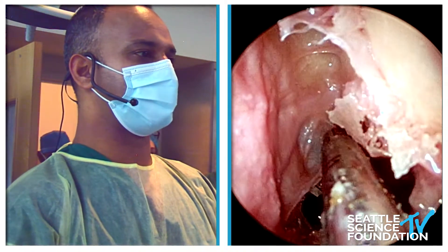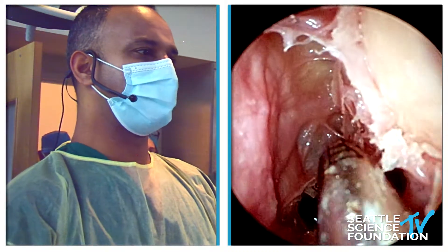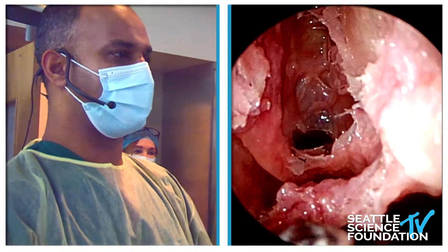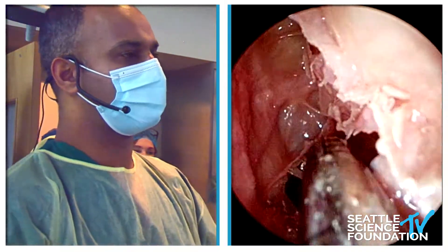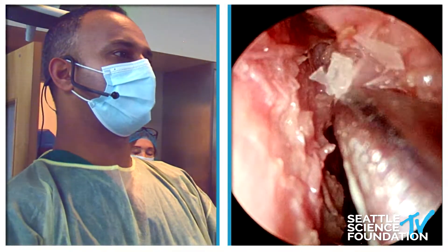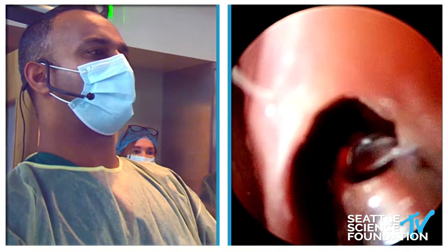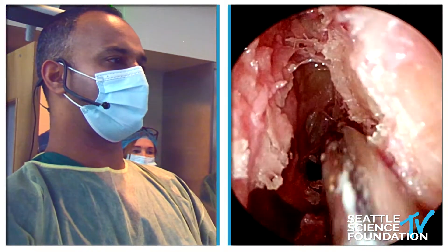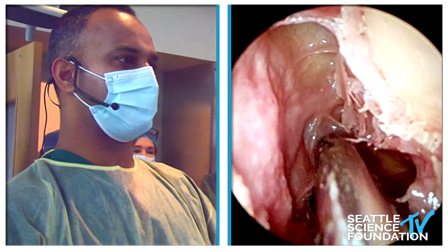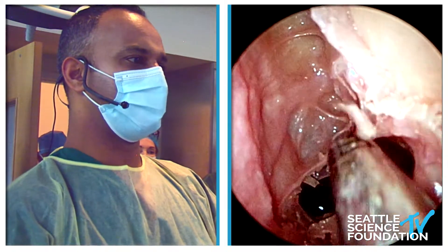Because when Greg showed us with that balloon, we saw the supra-agger frontal cell that goes past the ostium. Here you can see that Winston had nicely broken away all these, but not taken away some of those ridges. And then what I might do is just look up with the 70-degree to try to show some of those. I just wanted to try to clean that posterior ethmoid so that you could see those boundaries that Winston was talking about and put the image guidance onto it.